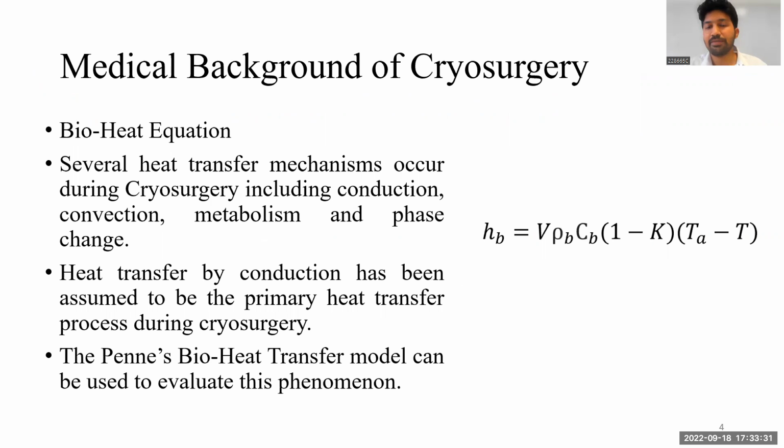Here we have demonstrated the bioheat equation. So the Pennes bioheat transfer model can actually be used to evaluate the phenomena of heat transfer through conduction, convection, or metabolism when it comes to bioheat transfer.